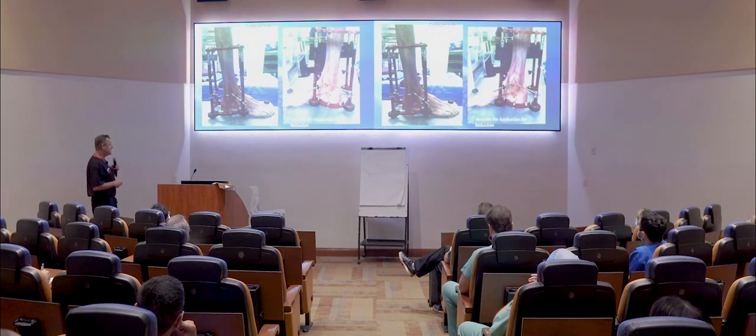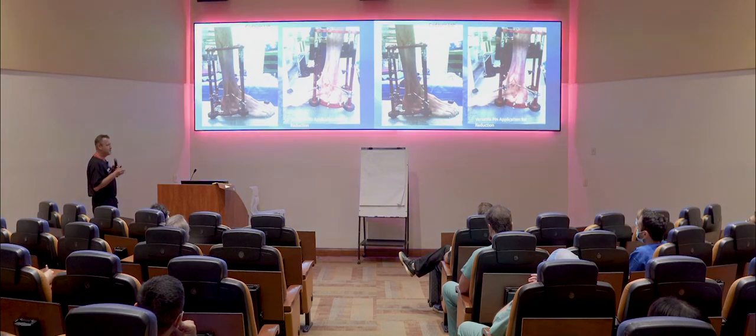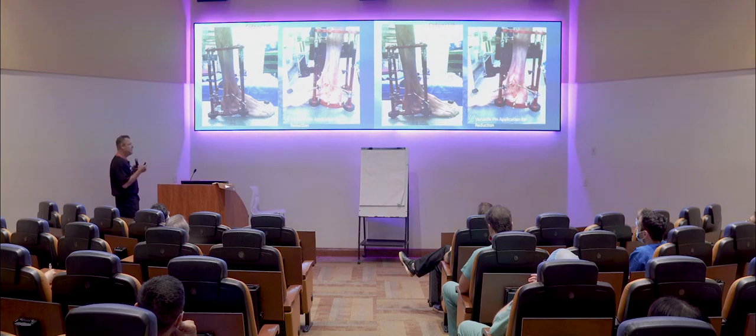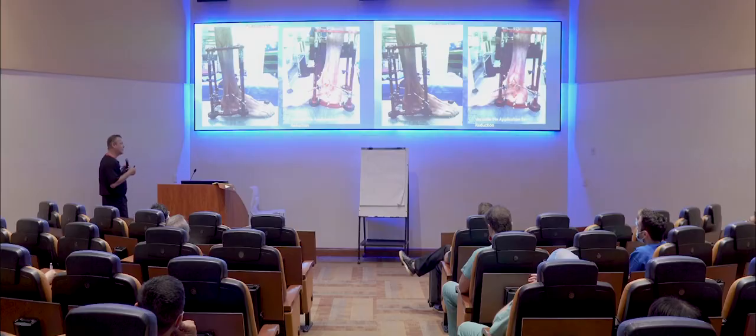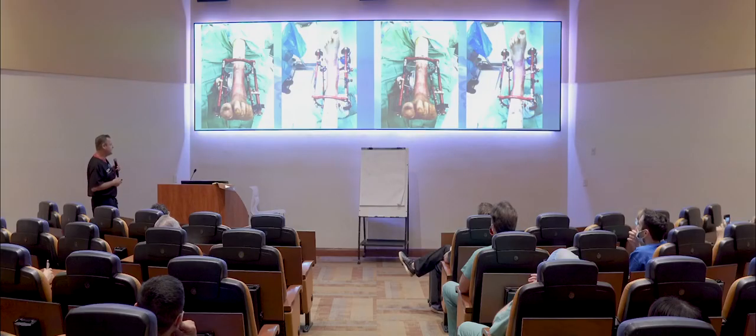Again, this is actually in a cadaveric lab. You can see where the wonderful thing about this speed frame, especially utilizing pins and wires off the struts, it's the only strut on the market that you can put a clamp that holds a pin or a wire on the strut and compress and hold it without damaging the strut itself. There's no other strut that I know of that'll take that sort of pressure. And this is just an example of reduction with a bimal.